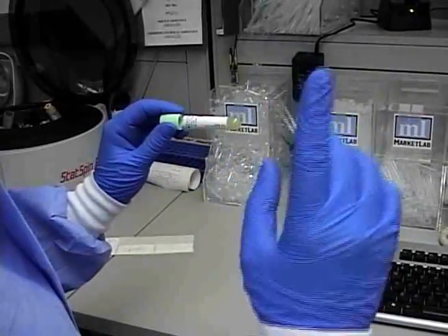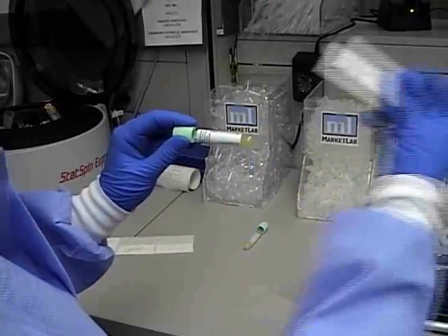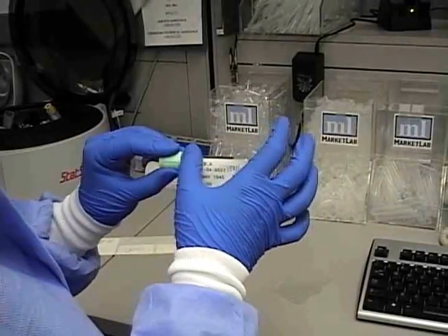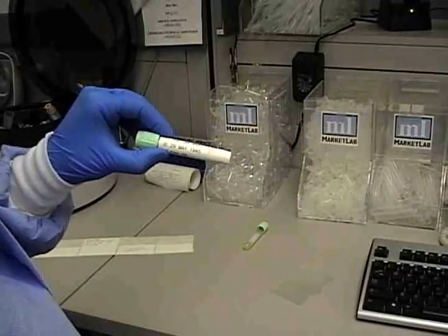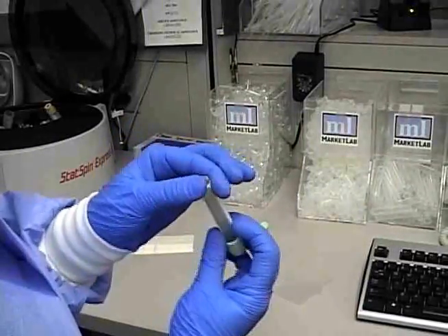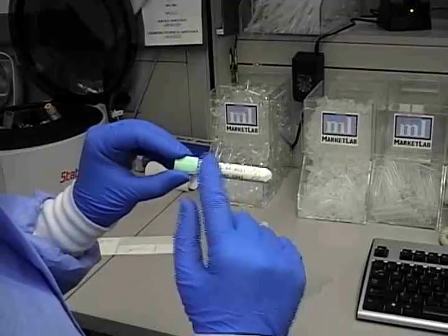Step number 2. Take your patient label. Step number 3. Line up the label with the tube label and stop. And finish. If there's a little overhang, that's okay. Just curl it over. That there is a properly labeled tube.